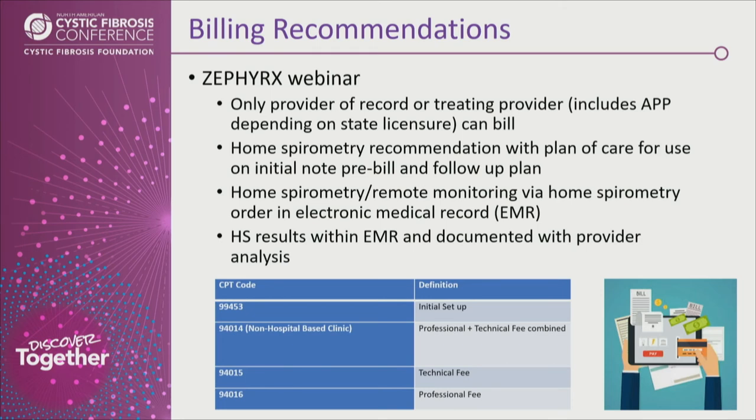It's also important to have an orderable, right? Like anything that we do, everything needs an order, and this is one of them, especially if you're going to bill. So please be sure to do that. And we were told that this order is good for one full year. You don't need to put it in every time, although I believe it's different in different institutions. Dabney's institution is scheduling these remote coaching visits, so that's different.